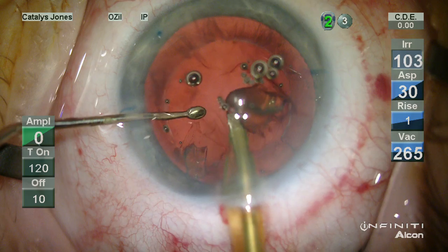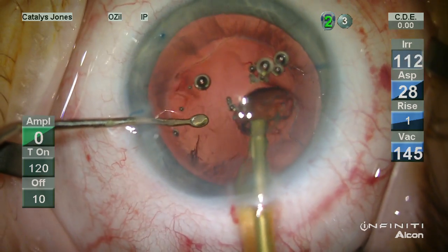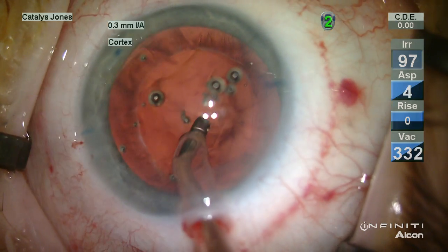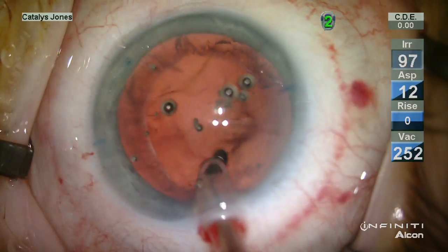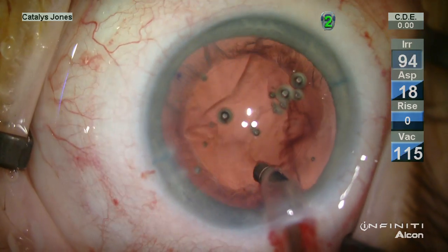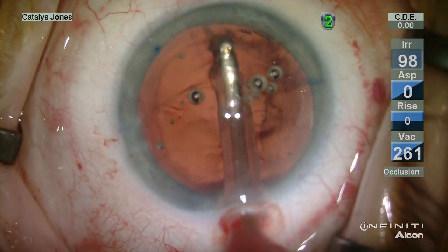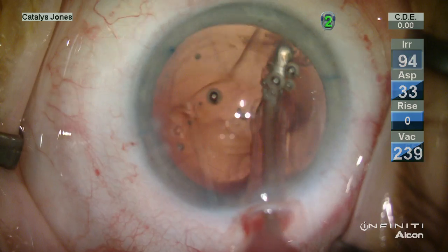No ultrasound energy has been used during this nuclear evacuation. Cortical removal is very normal using a standard coaxial IA tip, and it's very efficient as well.